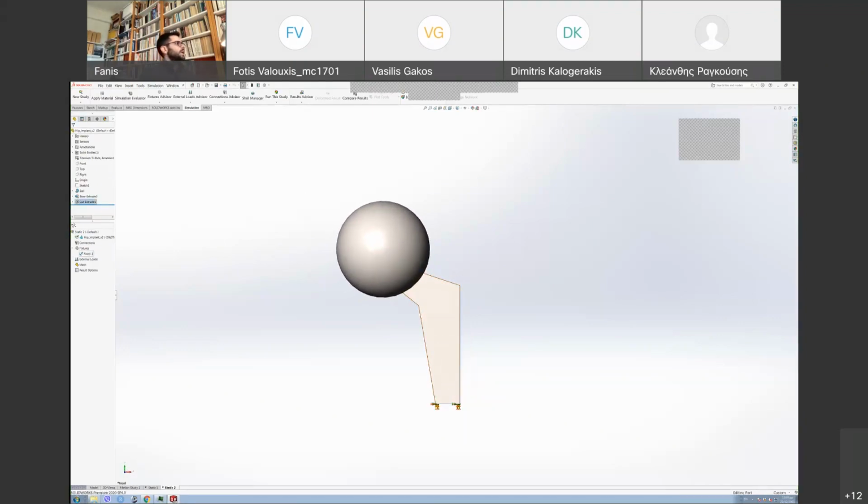Okay. Now we are also going to apply external load. We're going to have a force. Now, also something to keep in mind, having concentrated forces, it's not very realistic.